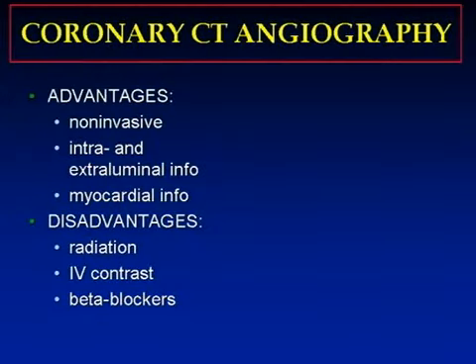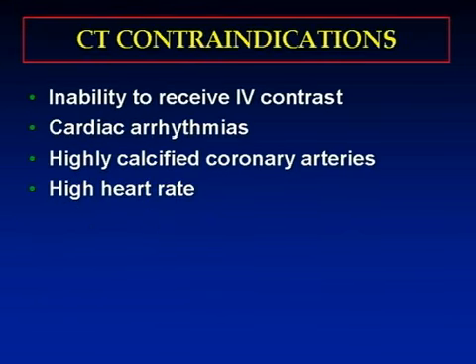So there are many advantages to coronary CT angiography, including the fact that it's non-invasive. We get both intra and extraluminal information about the coronary arteries as well as information about the myocardium. The disadvantages we're well aware of, the fact that we need to give the patients radiation, intravenous contrast, and often we need to give the patients beta blockers. What are the contraindications to CT angiography?